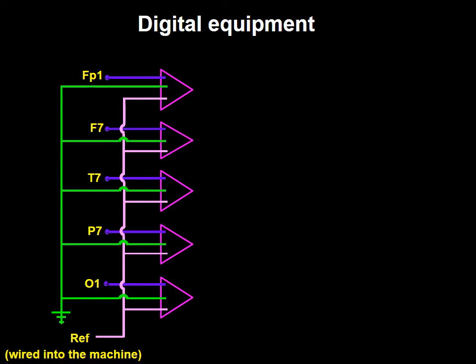By this approach, a single value is given to each amplifier and thus to each electrode entering through G1.